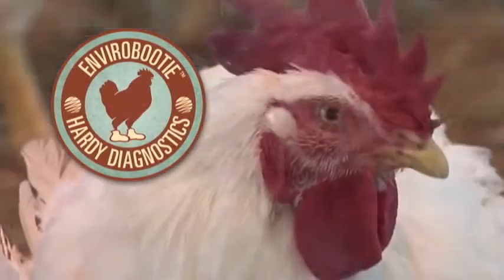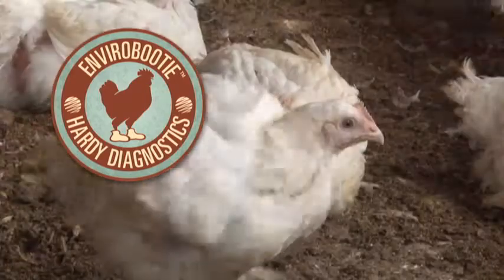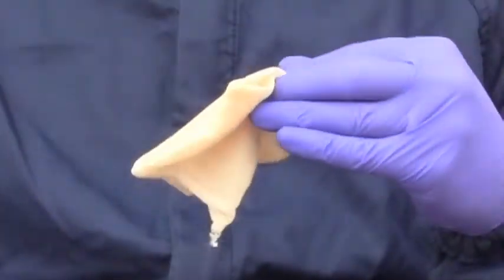Envirobooty is a collection system for the monitoring of salmonella contamination in flock floor litter and other surfaces. This one-size-fits-all shoe cover is ready to use and pre-moistened with skim milk.